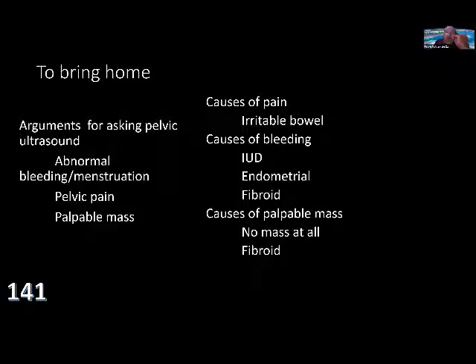If you know anatomy and you know what's up on the screen, down the screen on each side, then you are being clinical with the ultrasound, because ultrasound is basically a prolongation of your sight. It's not like x-rays. It's you looking inside so you can know what's going on.